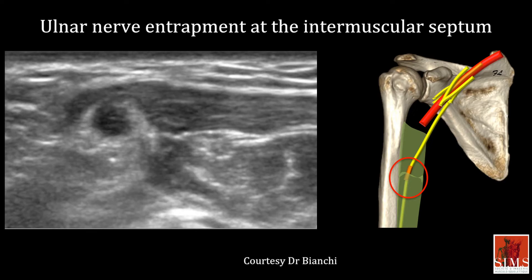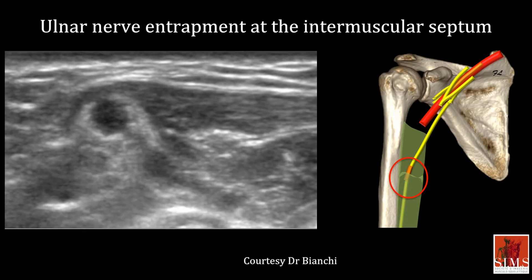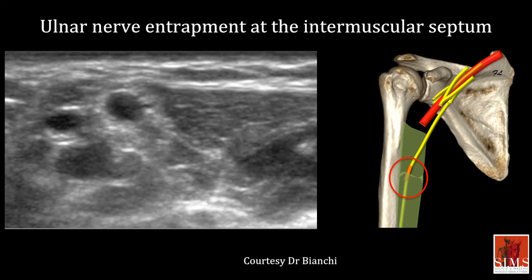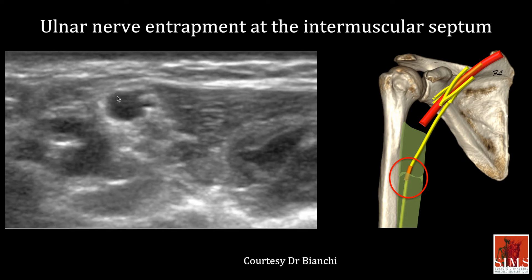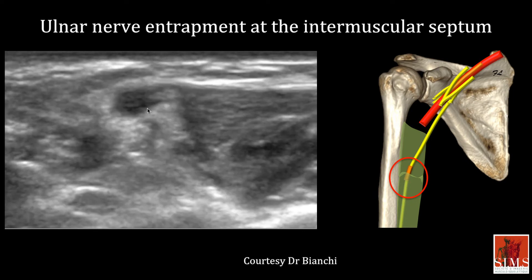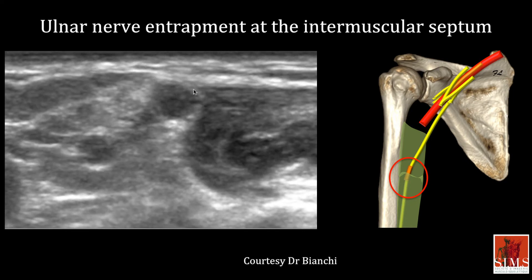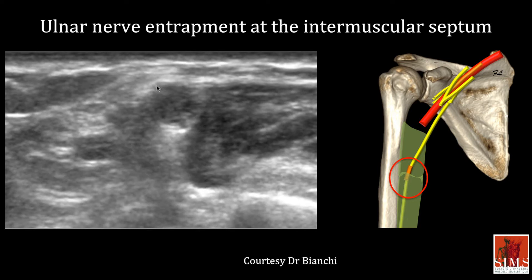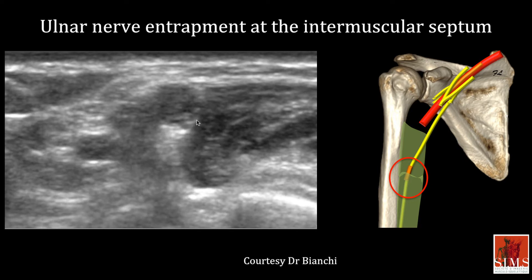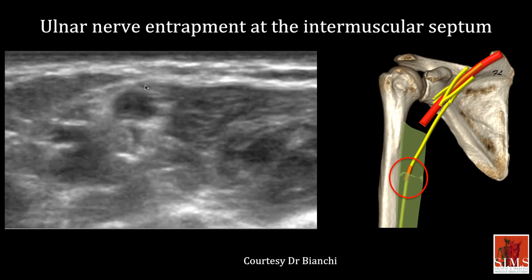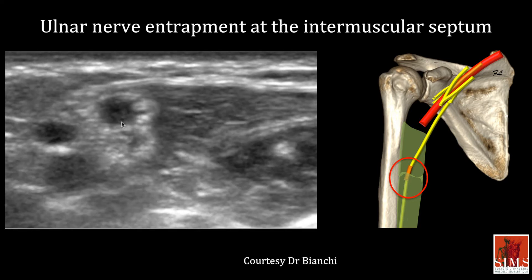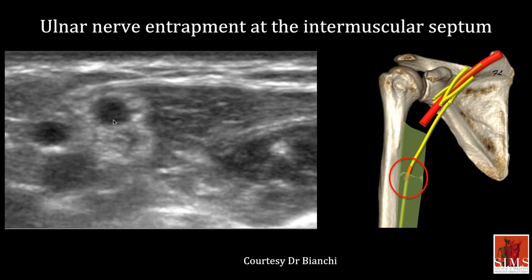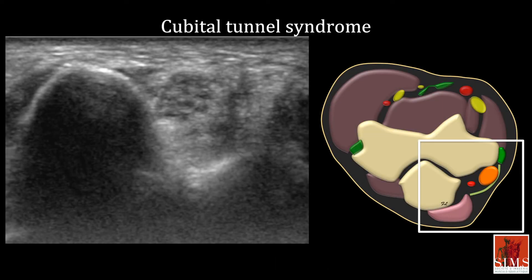The point where the ulnar nerve pierces the intermuscular septum is a classic but rare site of ulnar nerve entrapment. Here you see a very enlarged ulnar nerve that pierces the medial intermuscular septum with difficulty and remains thickened below it. Tracing it back above, you also see this hypoechoic and thickened appearance.